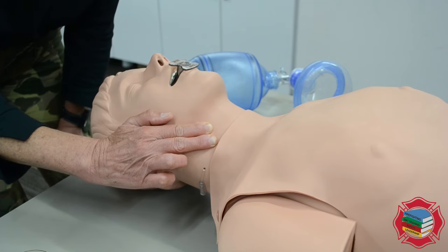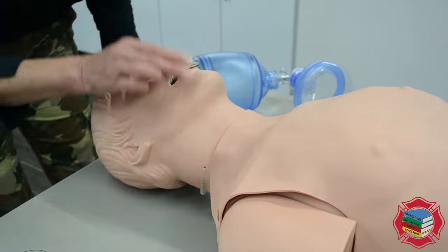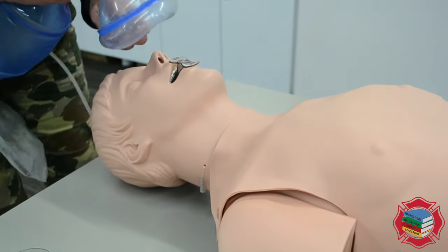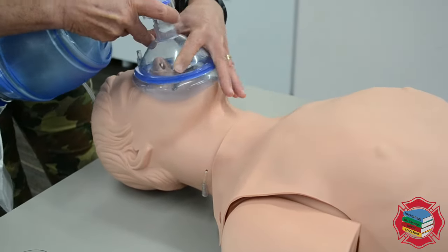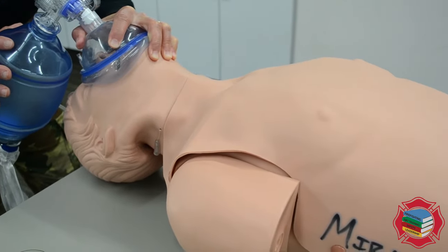One one-thousand, two one-thousand, three one-thousand, four one-thousand, five one-thousand — patient still has a carotid pulse. So I'm now going to go back and continue ventilating at one breath every five to six seconds.